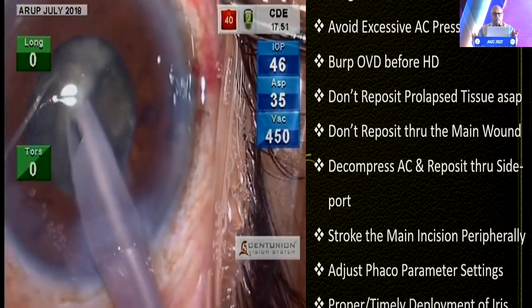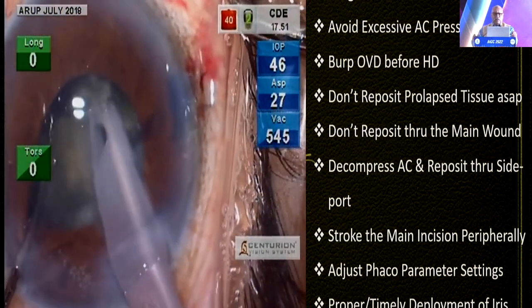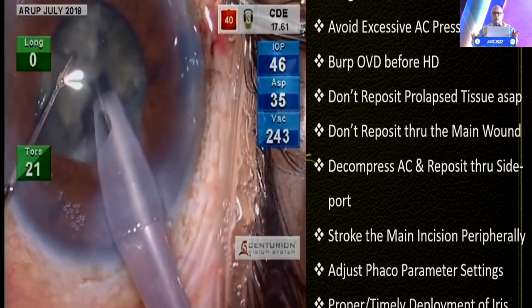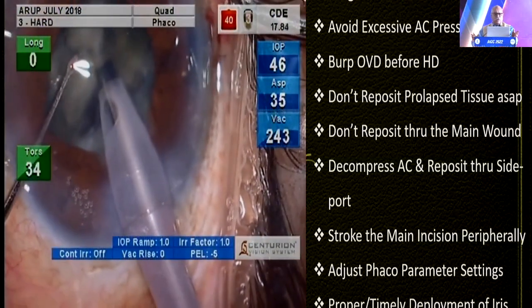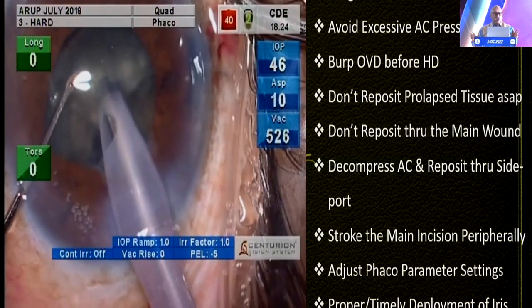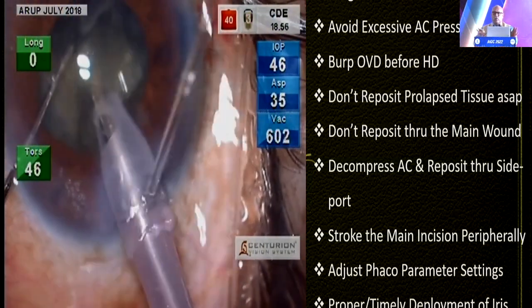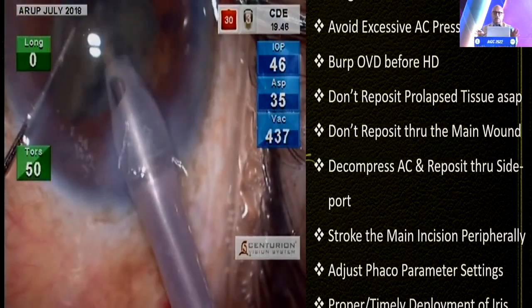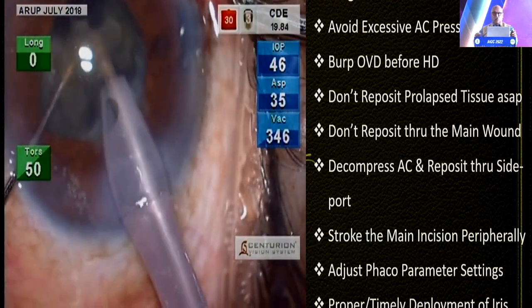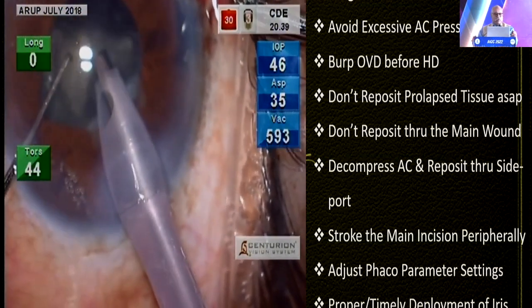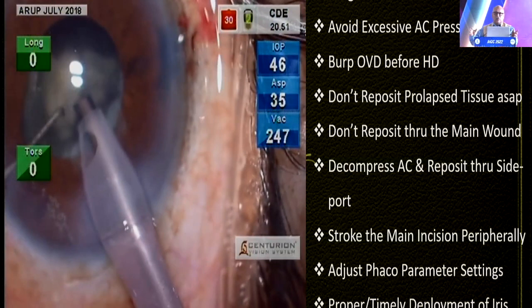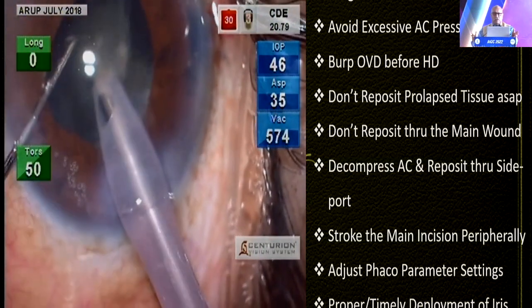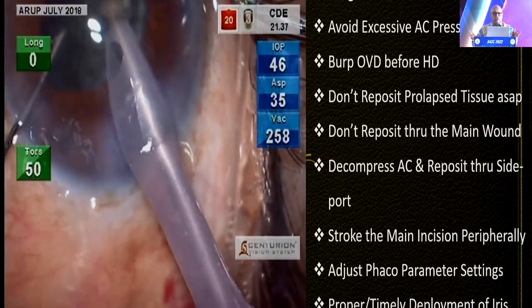I didn't go for direct chopping here. Fortunately for me, it was a brittle nucleus, so chopping was not very difficult. One has to be careful about fluidics in this situation. Make sure that the irrigation stream coming out of your phaco handpiece does not hit the pupillary margin or go behind the pupil to stimulate the muscles. Likewise, avoid working with very high vacuum or bottle height, and the flow should also be under reasonable limits.